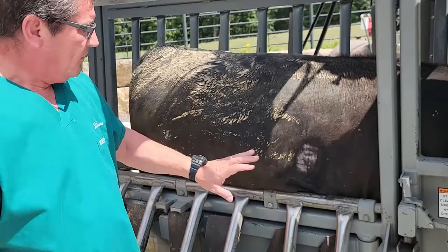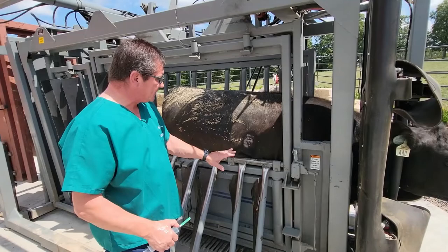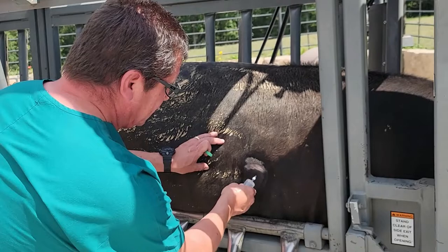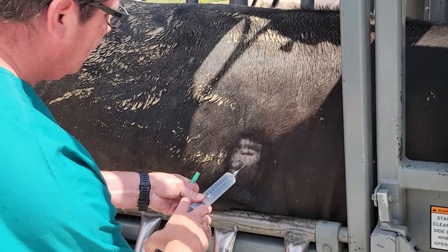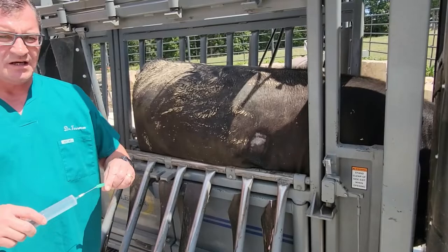We'll shave that up and clean it. Once you've got a good initial scrub and the area is clean, you can use lidocaine for local anesthetic. Put a little bleb underneath the skin — one to two mils — and then some deep into the muscle layers.